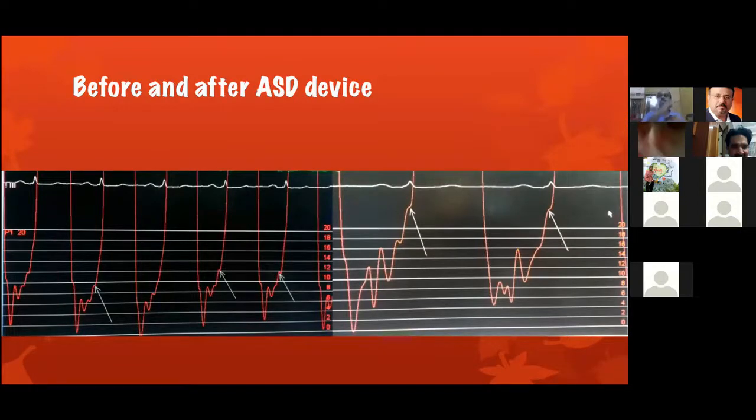Immediately it reflects onto LA pressure, reflects onto RA pressure. So RA pressure is going to show definitely a pressure of more than 8 millimeters of mercury. If you have an RA pressure of 2 or 3 millimeters of mercury to start off, that patient is never going to get a restrictive left ventricular end diastolic, restrictive LV physiology, because he cannot raise the left ventricular end diastolic pressure to 24, 25 millimeters. So this is what is identified by this curve.